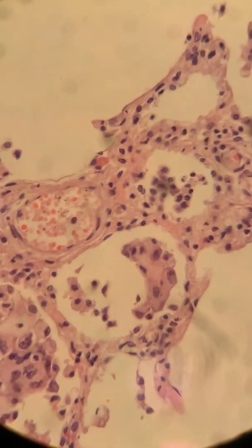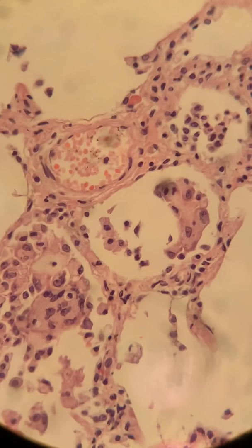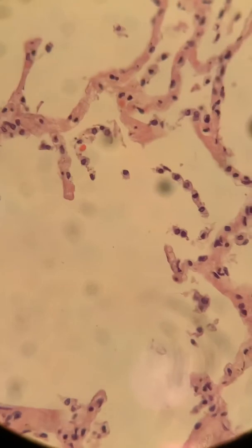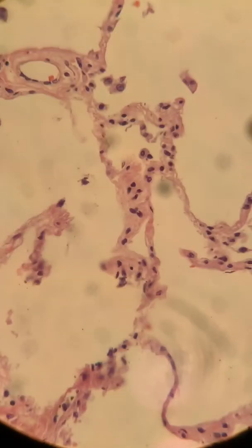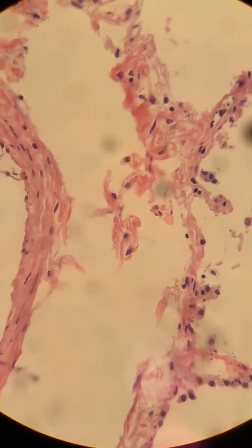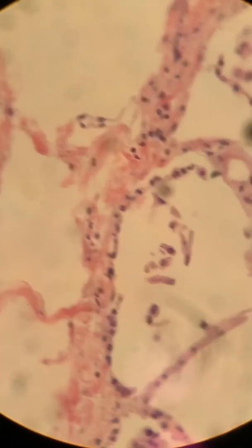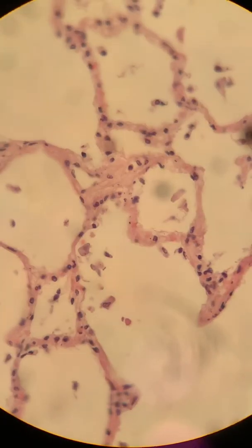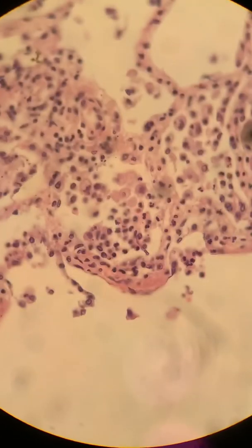Okay, there are some neutrophils there within the alveolar spaces. Those are foamy histiocytes there. So we're going to keep on going around. It's kind of difficult to show on these random sections here. But when you see it under the microscope, it's a little more obvious to see.